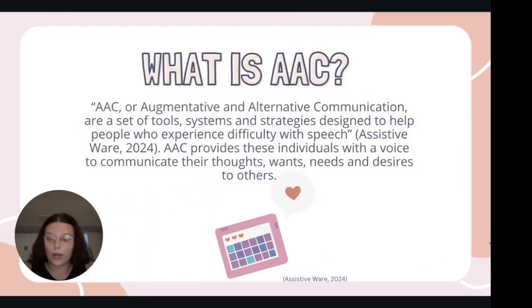Now, I'm sure you're wondering what an AAC is. AAC, or Augmentative and Alternative Communication, are a set of tools, systems, and strategies designed to help people who experience difficulty with speech. AAC provides these individuals with a voice to communicate their thoughts, wants, needs, and desires to others.